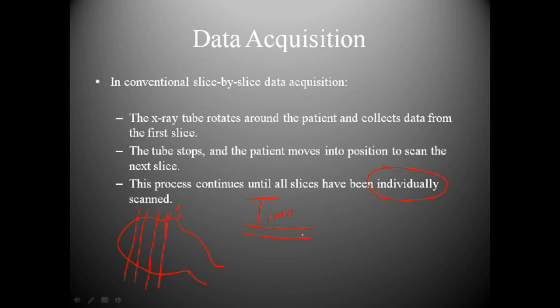However, for facial bones and all of that, we were utilizing volume reconstruction. And some of my colleagues and I were getting really fancy utilizing all these 3D images, and the physicians were beginning to expect that. However, we had done it a couple times on the head using our trauma or quick head series. But typically on most patients, we were utilizing just the slice-by-slice method. And so I scanned the patient utilizing the slice-by-slice method.